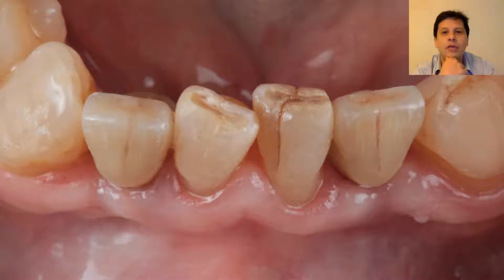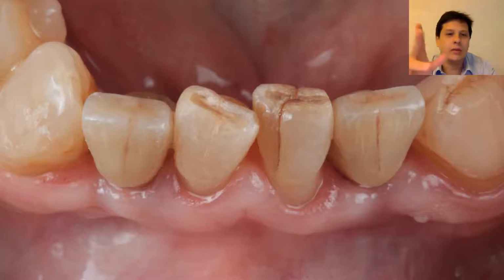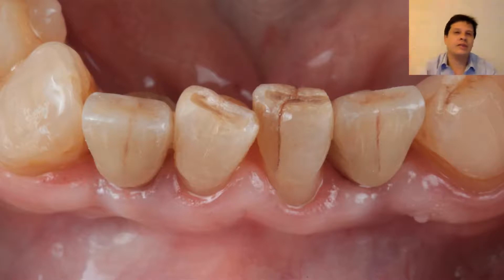So here you have an overview of the situation. You have 2 lateral incisors just about the same as the central incisors, and the patient says, okay. Of course, you can do veneers in here, you can do everything, but this is a 70-year-old patient, a granny that just wanted 2 lateral incisors. You're not going to place them very wide. You're just going to follow the rules. And this is a perfect example that by doing everything together, you have a nice result.